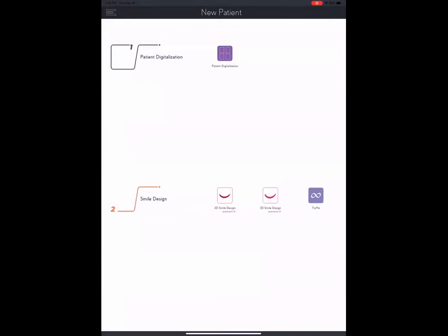So let's say you got your patient, she came in your practice and she's looking to replace that one class 4 restoration in that one central incisor. But you as a dentist, you know you can do much better than that. How can you initiate a conversation, change a patient's mindset towards a more complete treatment plan?